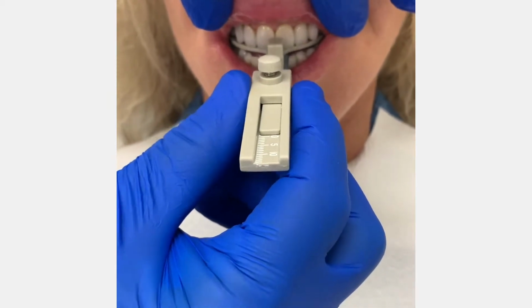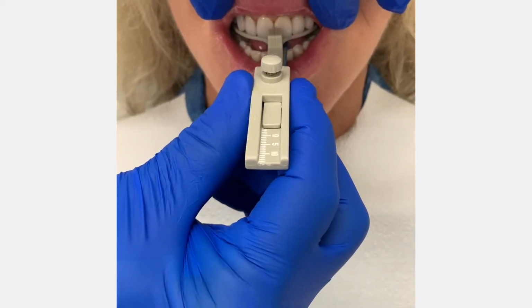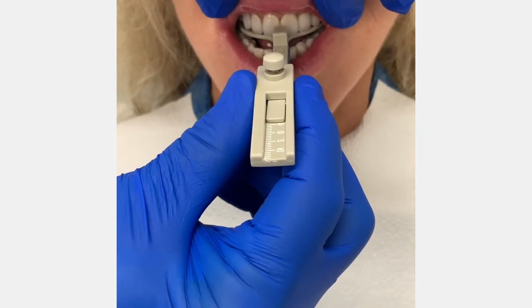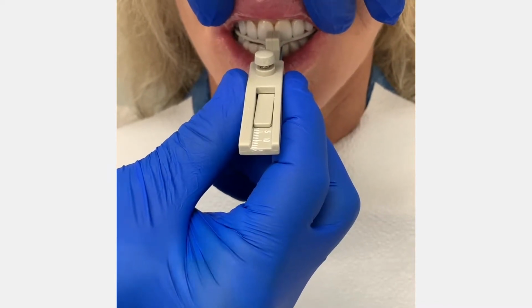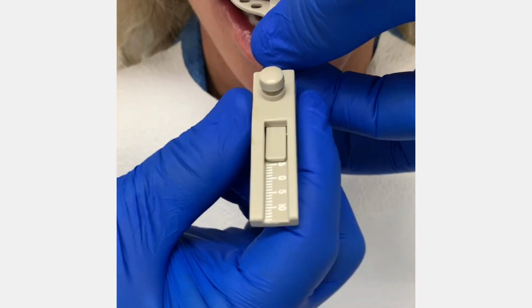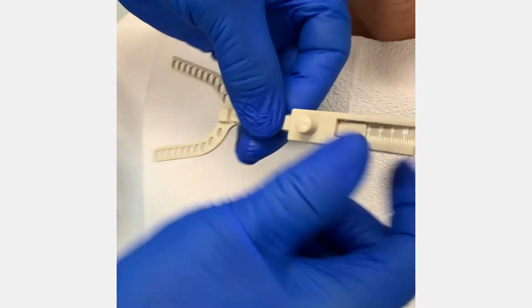Now we'll take protrusive records. You want to have the patient protrude as far as possible and back to CO. Move the jaw as far forward as possible again, back to CO. Do this several times. On the third time, I will usually hold the maximal protrusion, take the bite fork out of the mouth, tighten down the thumb screw, and just see how far they can protrude their mandible.